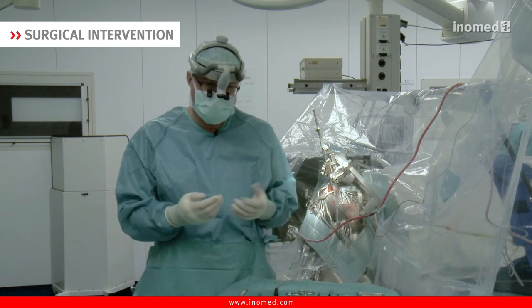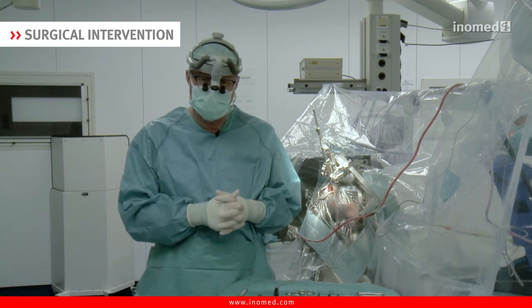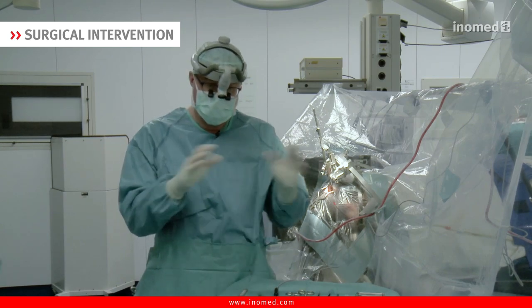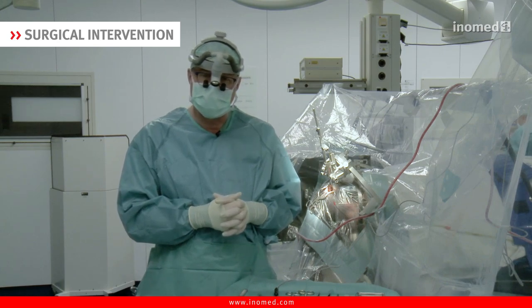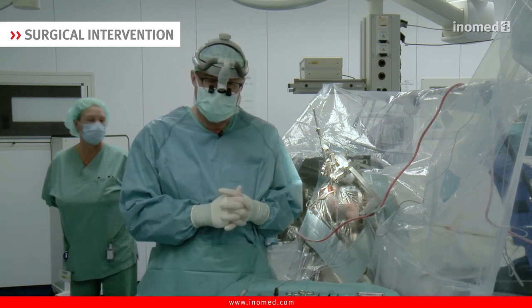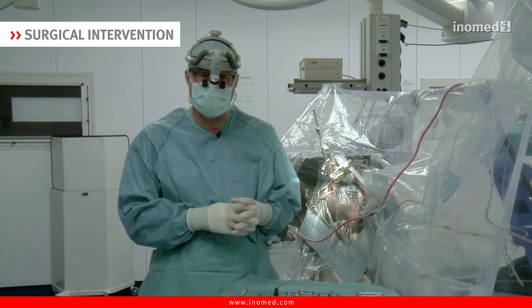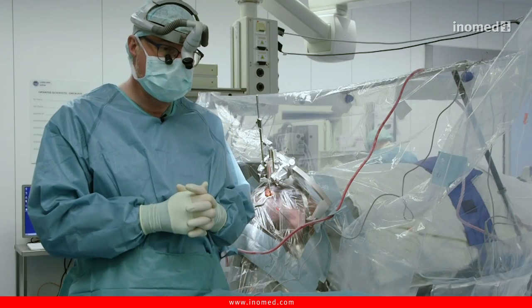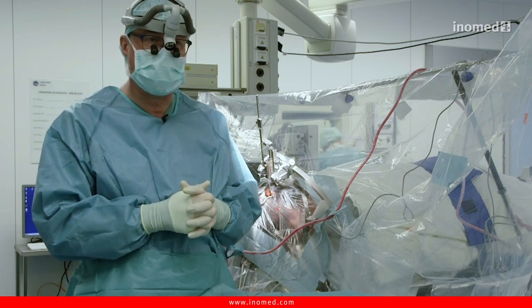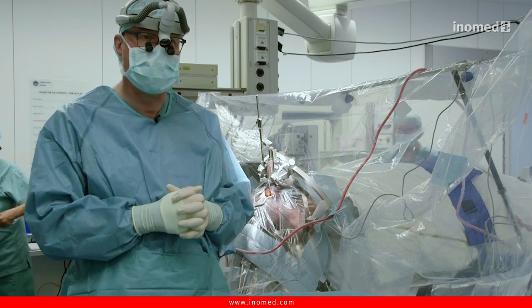As soon as the seeds are delivered to us, they are accepted by the physics department in the strength we have ordered from our suppliers and temporarily stored in an isotope laboratory. You can also store the seeds in the operating theatre in a special safe — you don't necessarily need your own isotope laboratory. Medical physics accepts this delivery and is also responsible for it. The seed storage is located in the territory of the medical physics experts, who have a special radiation permit. The handling of radioactive substances is generally subject to authorization. We need a whole series of licenses issued by the relevant authorities. Without these special licenses, brachytherapy cannot be performed in the operating room.